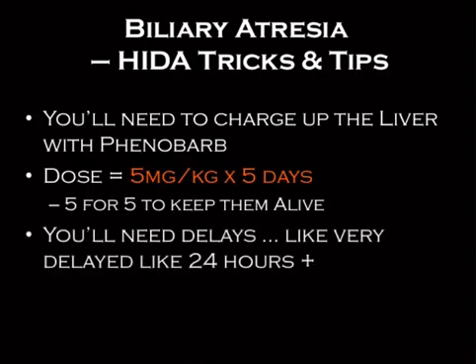And you're going to need delays, like really delayed, like 24 hours plus, because in neonatal hepatitis, like I said, it's going to hold on to that tracer much longer than you would expect it to. But it will eventually get into the bowel. This is a big decision, right? Because one of these guys is going to get surgery, and one of them is not. So you want to make sure that that is not getting in the bowel for sure. So that's the reason you really want those delays.